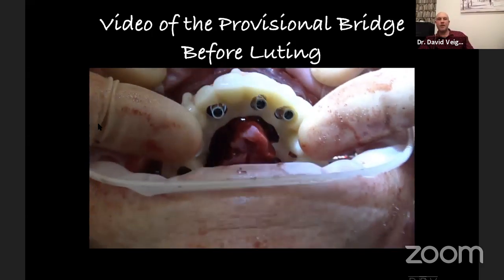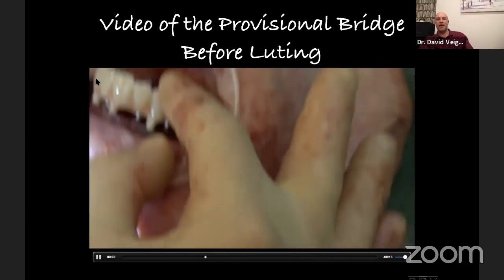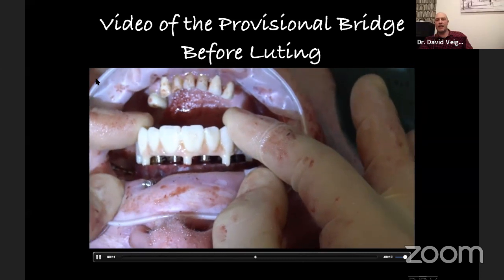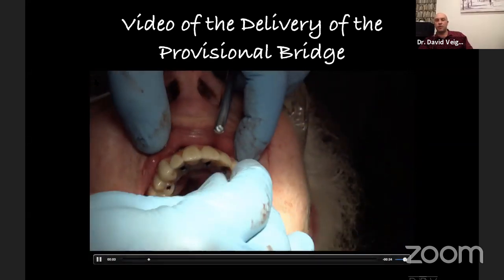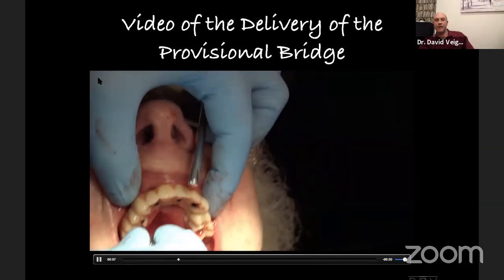Basically what I do is I pick that thing up off the side of the bench and sit it back onto the original surgical pin positions. I loop that on and then I take off the little feet that are in between. And then I close my surgical area and I bond that in. That will be the patient's immediate load temporary prosthesis for the duration of the healing phase.